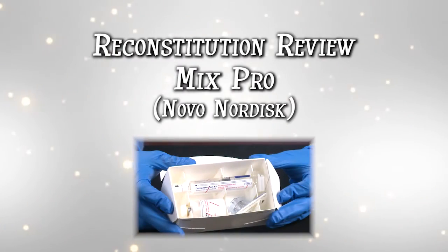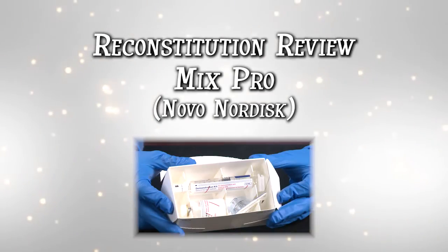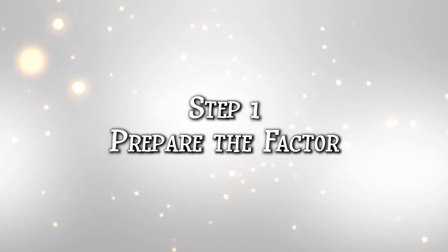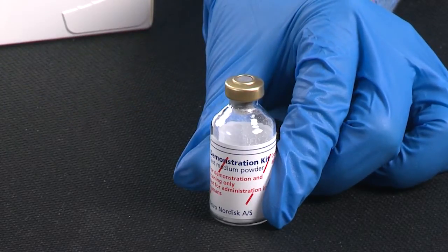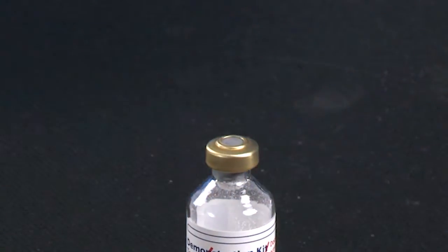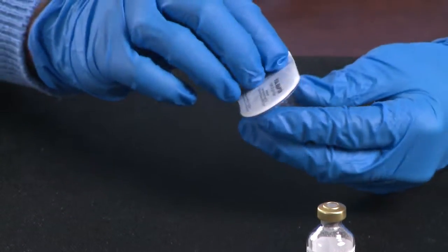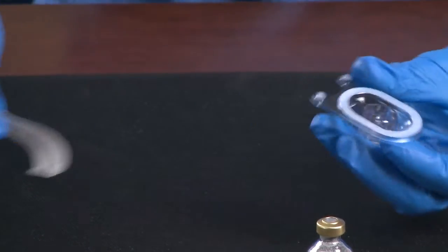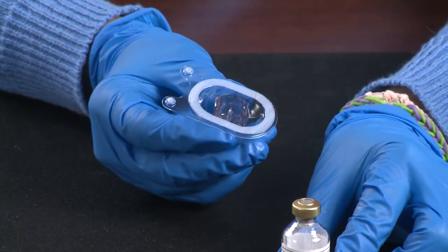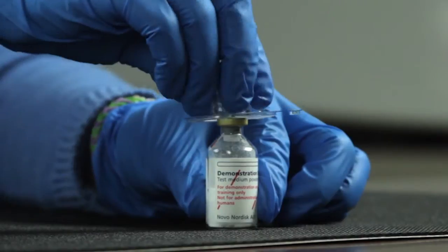Welcome to Reconstitution Review with MixPro, which can be used with Novo Nordisk products. First, remove the plastic cap from the vial and wipe the rubber stopper with alcohol. Remove the paper from the vial adapter, leaving the vial adapter in the protective cap. Place the vial on a flat, solid surface.